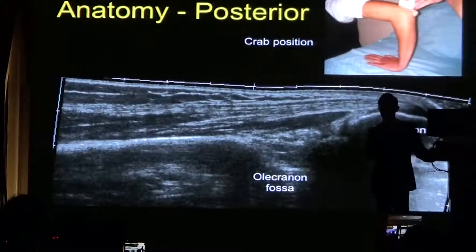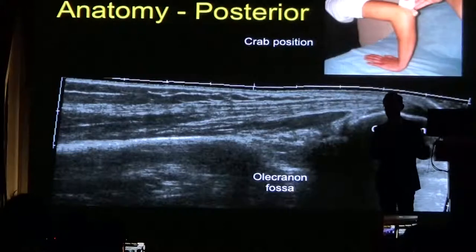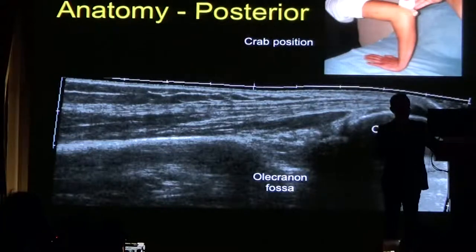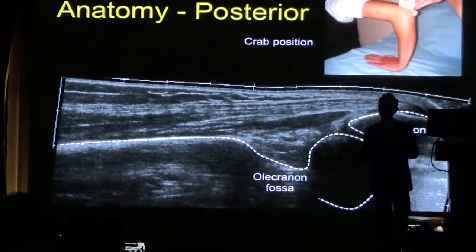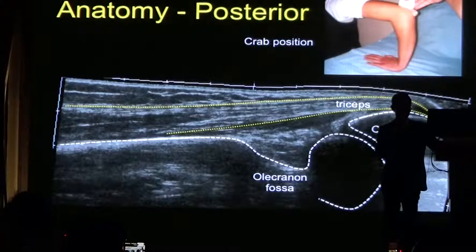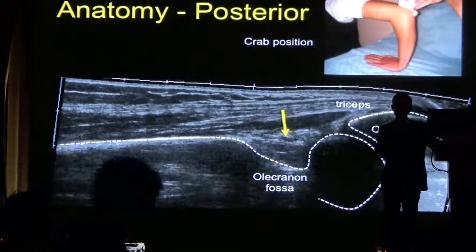We can then look at the elbow joint posteriorly. This extended field of view image shows the olecranon. Notice the patient is in what we call the crab position — the patient has the elbow bent up. Using jelly at the end of the probe, you can get good visualization around the corner. You can see the olecranon and olecranon fossa, which should be full of fat. The arrow points to the posterior fat pad, and you can see the triceps tendon inserting onto the olecranon.